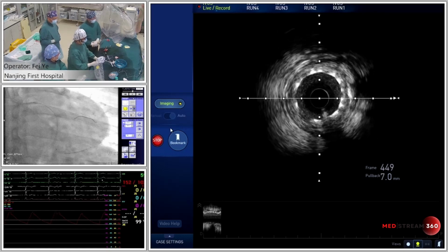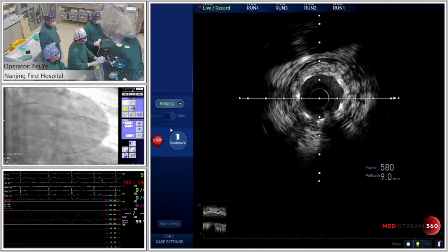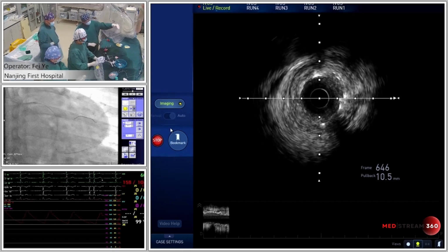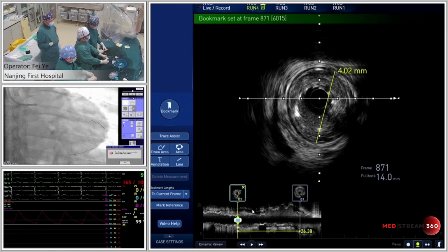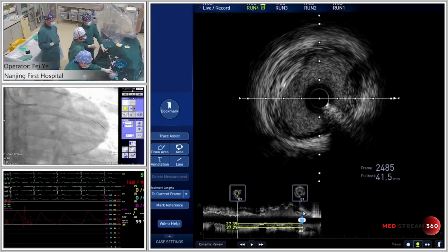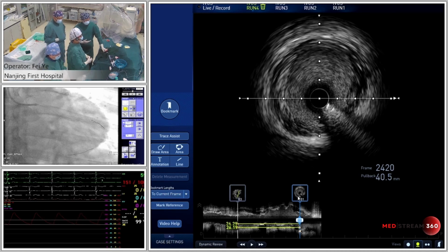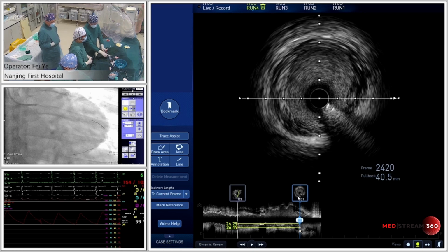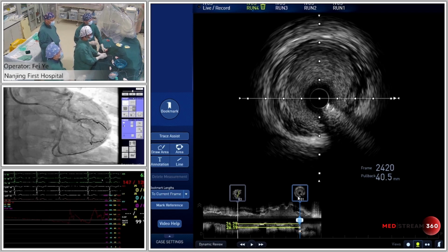So I think maybe next we use a large balloon for post-dilation at first, just before the bifurcation side. Yeah. Just because the angulation between the OM and the circumflex is very sharp and wiring was so difficult. How to protect the OM? Yes, a very important technical issue. Check the angle. After wiring, we want to check the angulation between the OM and the circumflex.